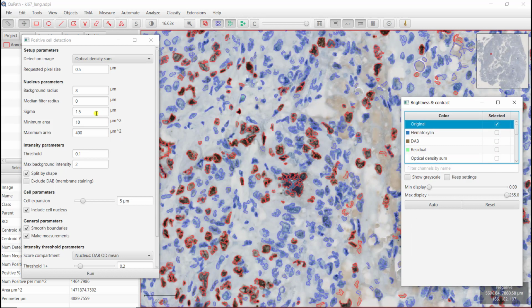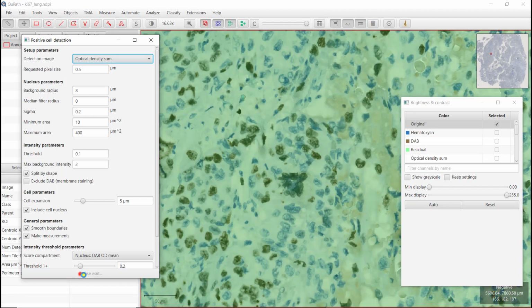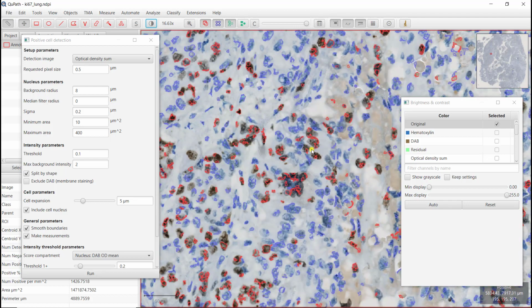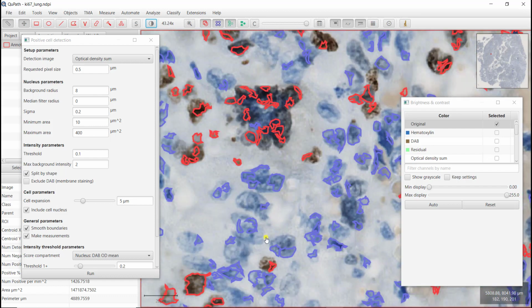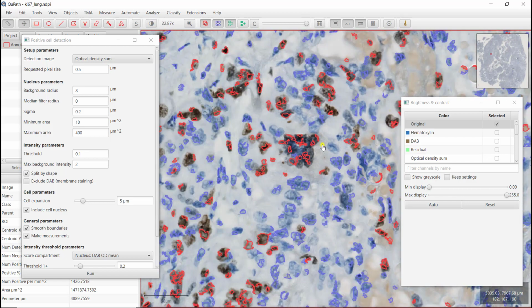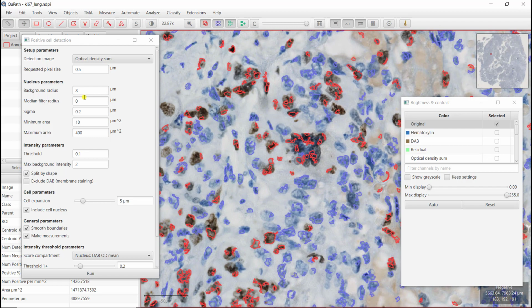So as I said, the main parameters, sigma and threshold, are the most important. If I get a small value for sigma, I'm going to over segment the nuclei. So I'm going to have very small or divided nuclei. And clearly you see here, we have several parts and even lots of missing parts, just because maybe we filtered them out. I forgot to talk about those two parameters.